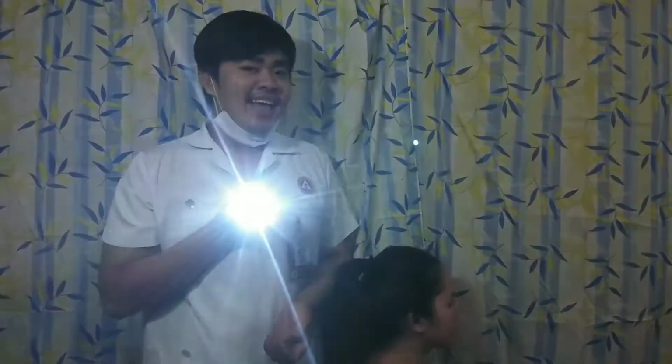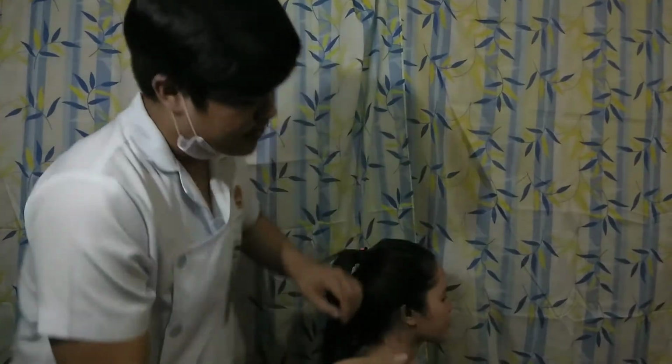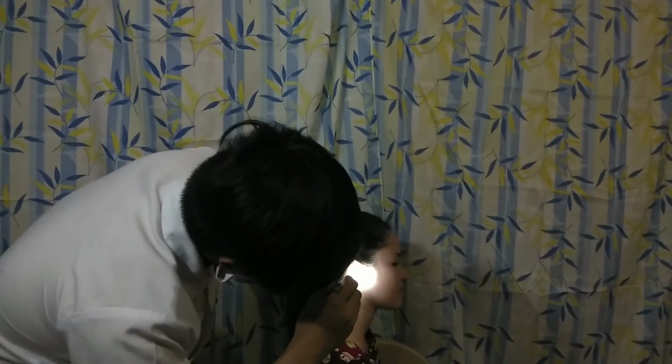Let us now inspect the tympanic membrane using our otoscope or penlight. We're going to inspect for the color, consistency, and landmarks. Ma'am, please swallow. Lumunok po kayo.